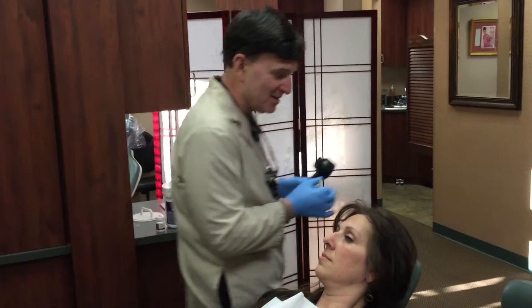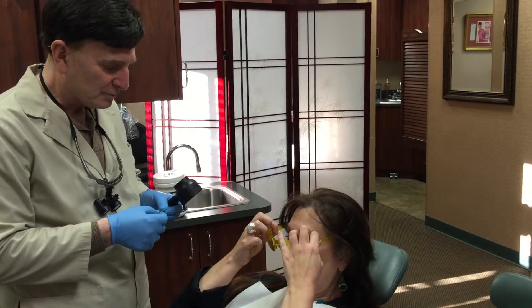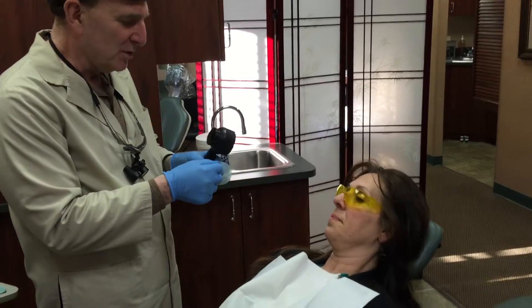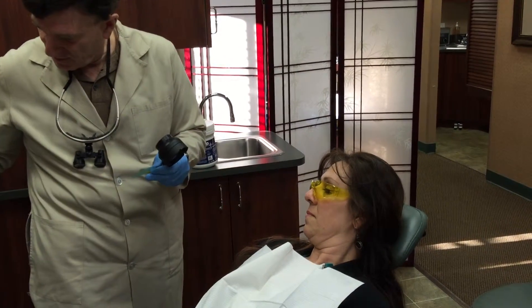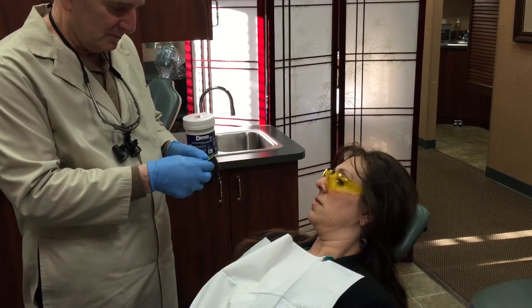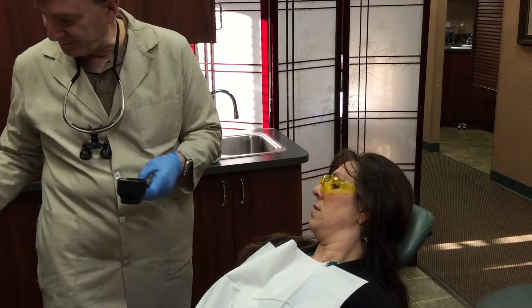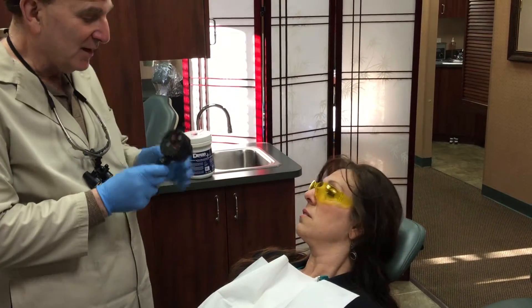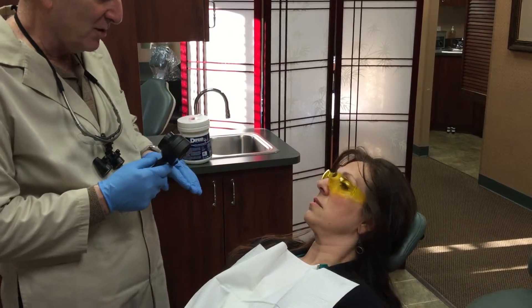So what I'm going to do now is get your glasses. I'm going to ask you to put these glasses on just to protect your eyes. What I'm going to do is put this sterilization shield on. So we peel one part off, then we peel the other part off. And now we're going to look in your mouth — a light's going to come out of here. It's a purple colored light and your tissues are going to turn a greenish color.